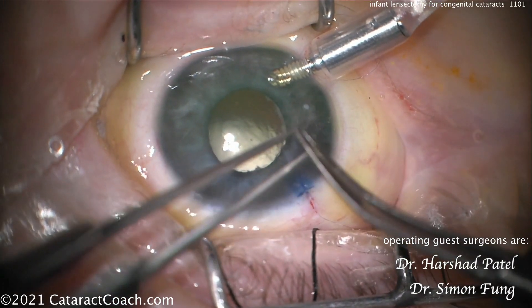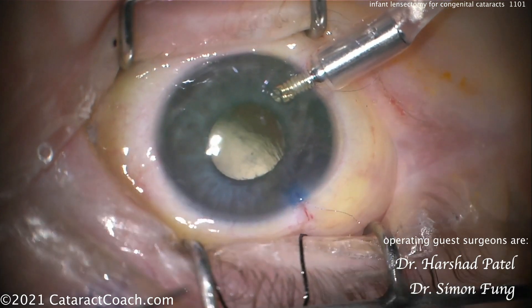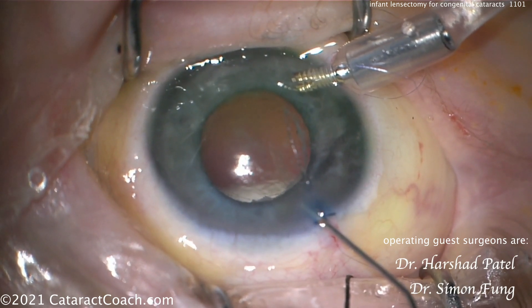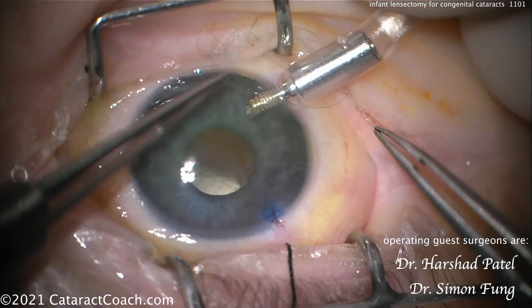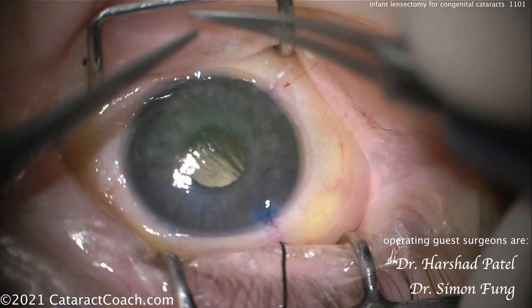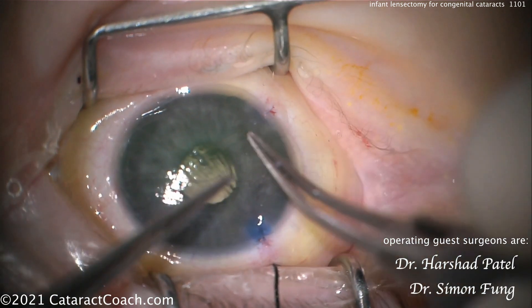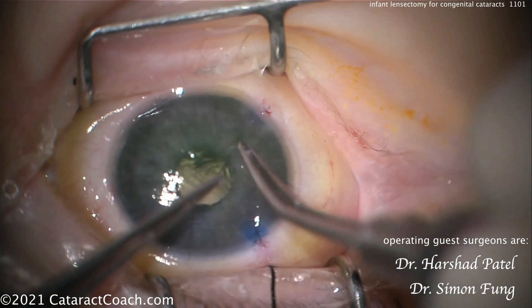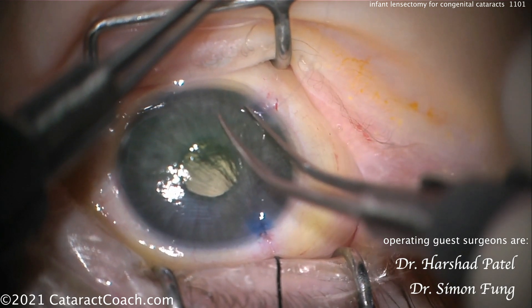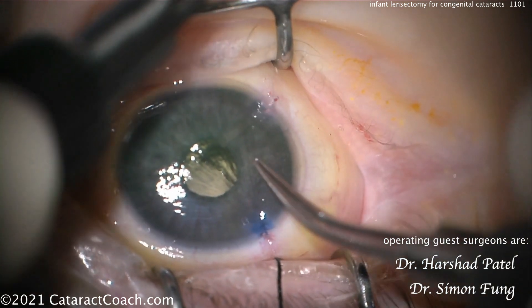At the end, suturing the incision. Putting in some triamcinolone — that's important to stain any vitreous in the anterior segment, and also to quell inflammation. Suturing of the incision is important. Even though it's a tiny small paracentesis, you might think you can just hydrate it, but that's not going to be sufficient — the cornea has way too much elasticity. You absolutely need to suture those two paracenteses. I'd recommend 10-0 Vicryl, so it'll fall out on its own and you won't have to go back to remove it. If you're going back to the OR for an exam under anesthesia or aphakic refraction, maybe use nylon and remove it at that time.